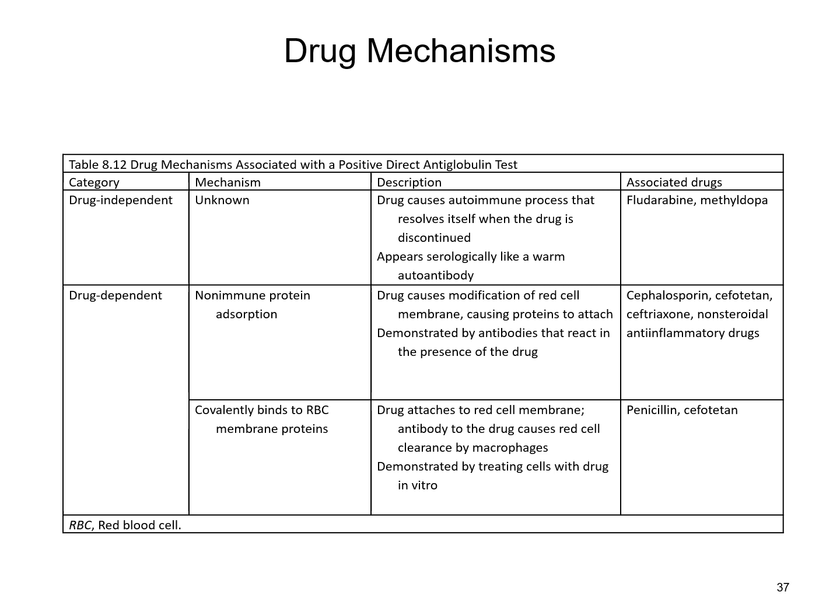They're going to do some testing. They're going to ask you to send the list of the patient's medications. So usually you're going to have to get the nurse to assist you with this, to send you that list of medications, and then you will send it with that sample to the reference lab so that will aid them in doing that workup to see if it's the drug that's possibly causing the issues.